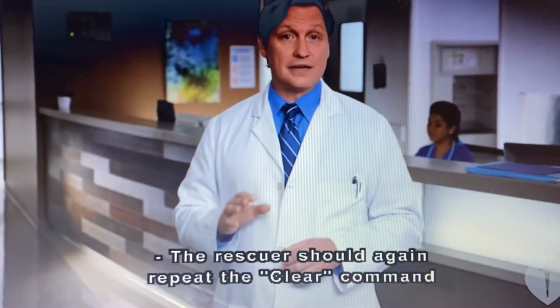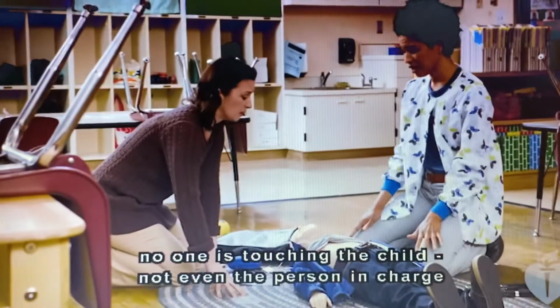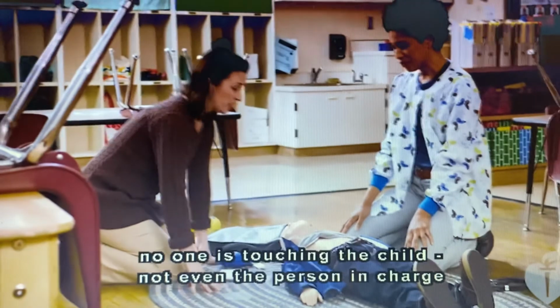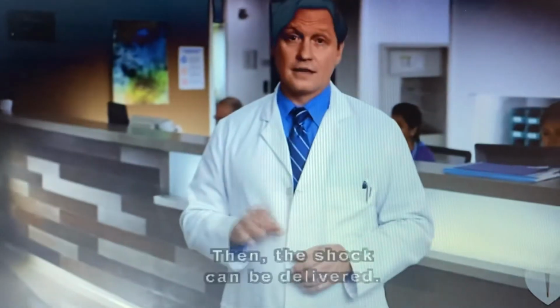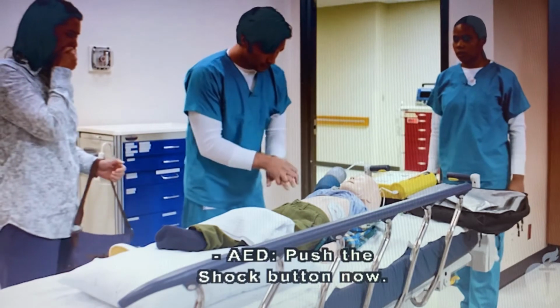Clear. The rescuer should again repeat the clear command to those nearby and visually confirm no one is touching the child, not even the person in charge of giving breaths. Then, the shock can be delivered. Push the shock button now. Next, press the shock button.